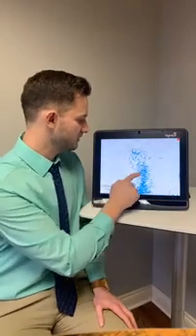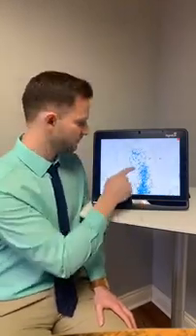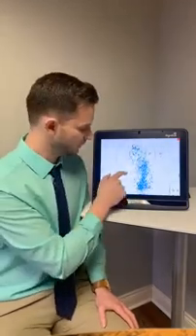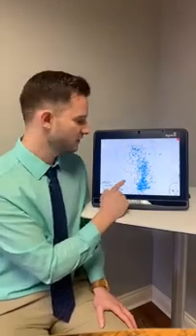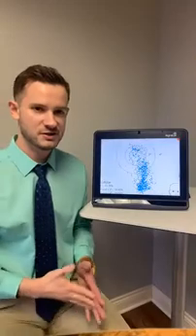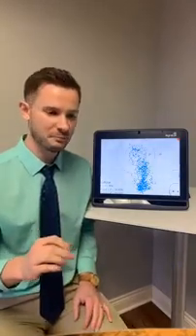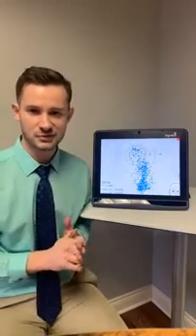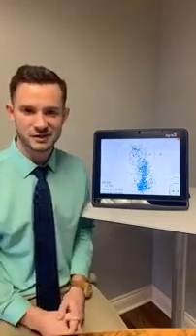Now the left eye, we can see that their left eye really struggled quite a bit more. There's not so many data points in that center and quite a few of them, this patient actually drifted downward below the target. So not only does this patient have a hard time with visual concentration holding still, but it's asymmetric between each eye. The right eye is probably this patient's more dominant eye and the left eye is drifting around, not really holding its weight, not playing on the same team basically.